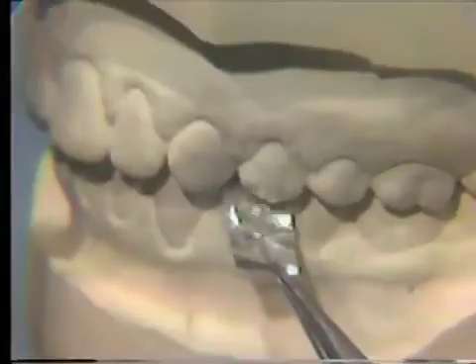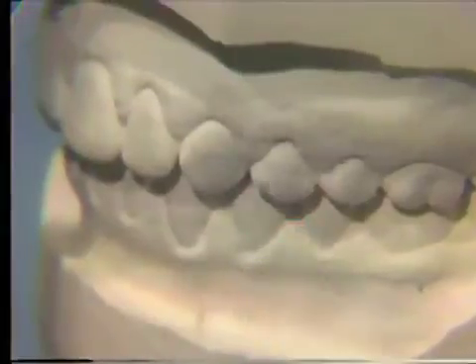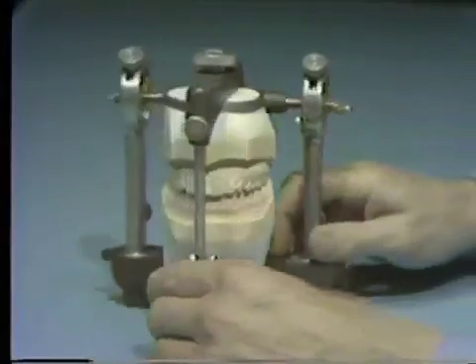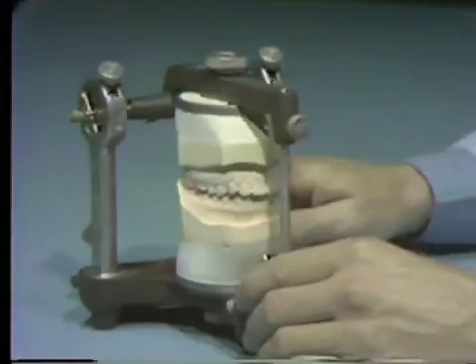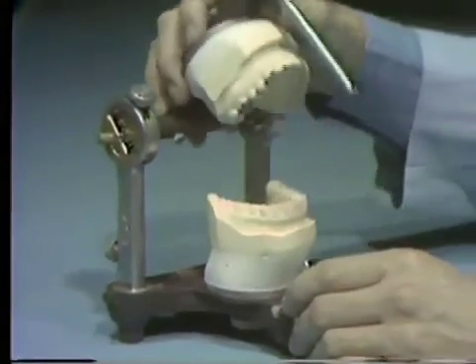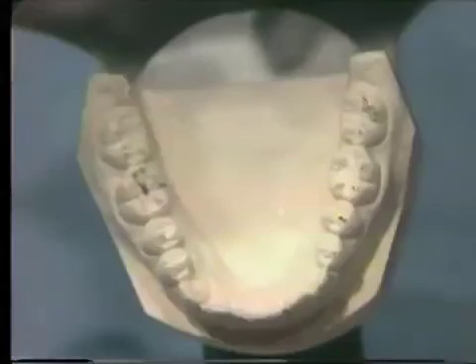Check all the teeth with shimstock for contacts in centric relation, and then examine the mandibular arch. The mandibular teeth contacting in centric relation are clearly marked with articulating paper. Notice which cusps produce the contacts in CRC, and also which part of the cusp is contacting.